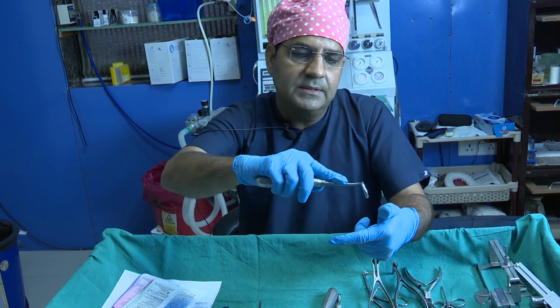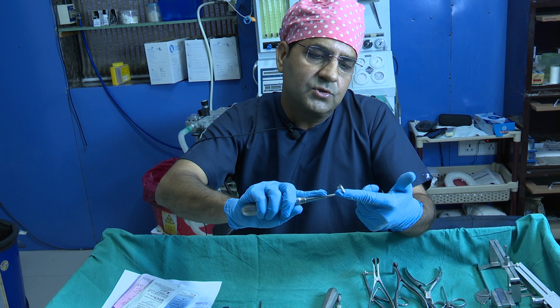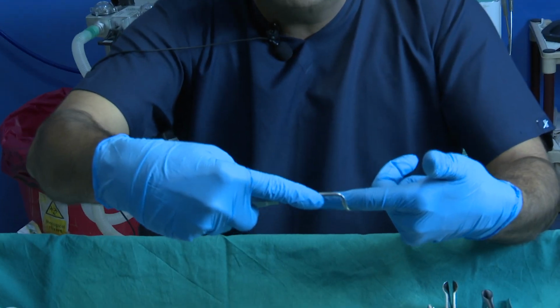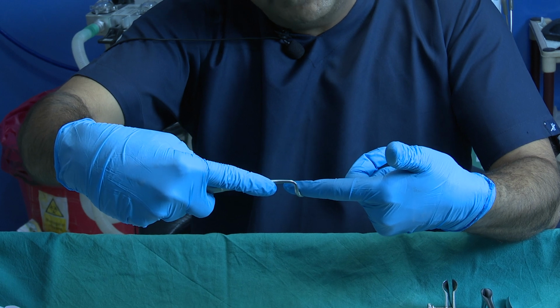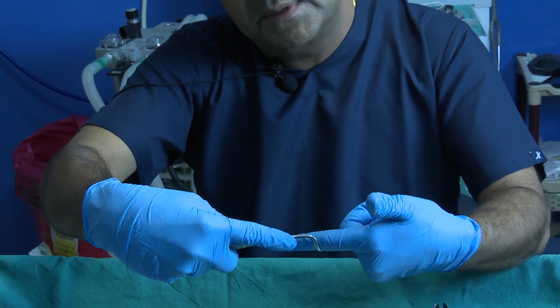The beauty of this is that after getting the plane, if you pass this instrument like this and scrape like this, you can very easily lift up the periosteum and perichondrium on the undersurface of the rib.